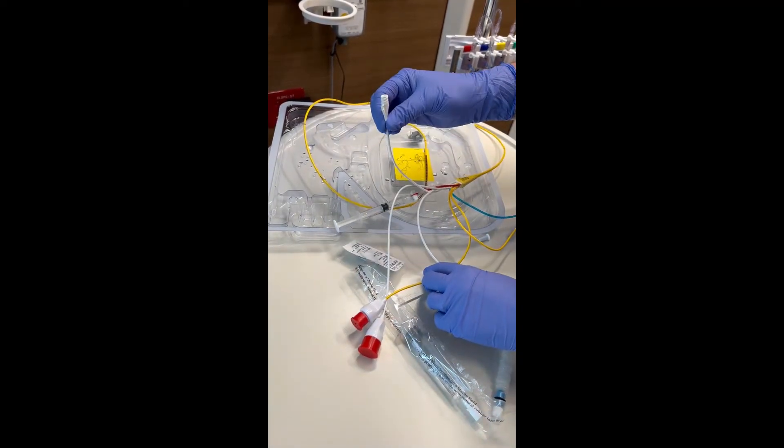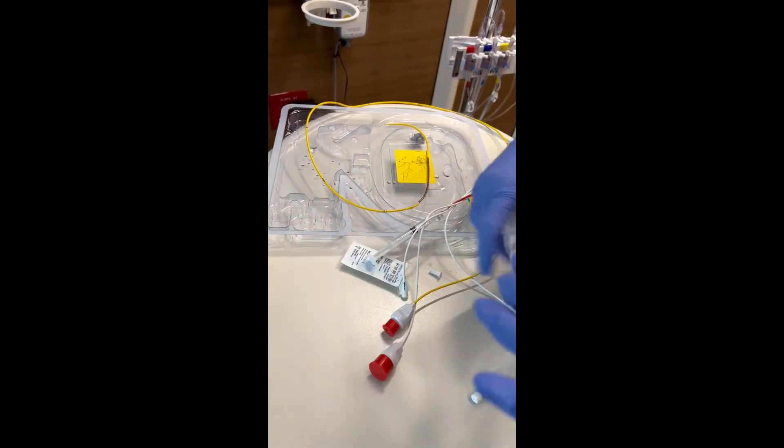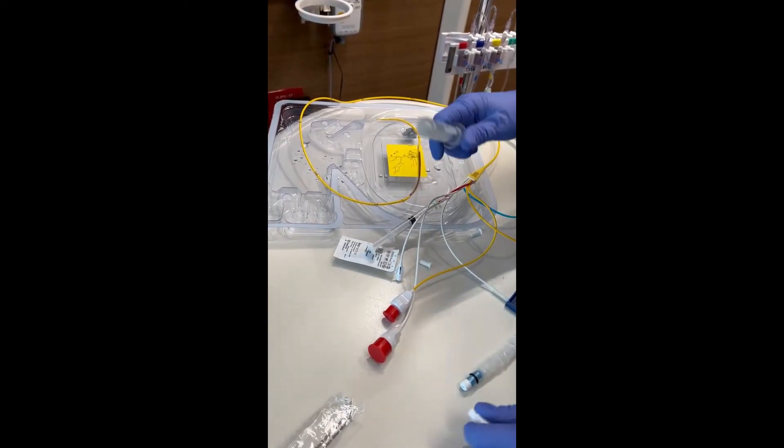And then this white one is an infusion port. Again, so actually while we're hooking these up and flushing them out, we can put a clave on here.